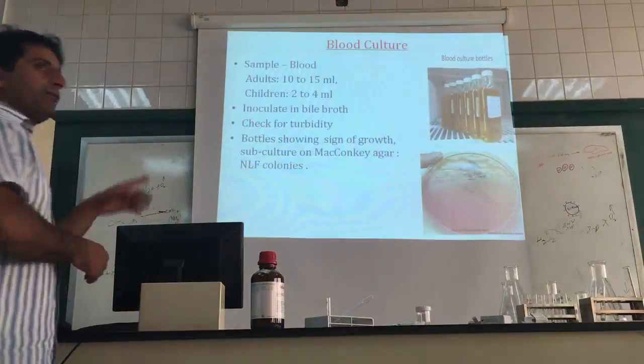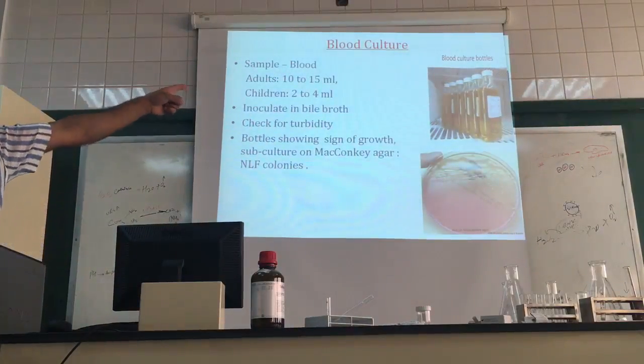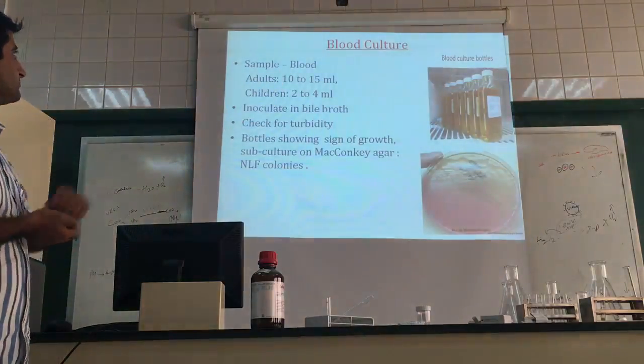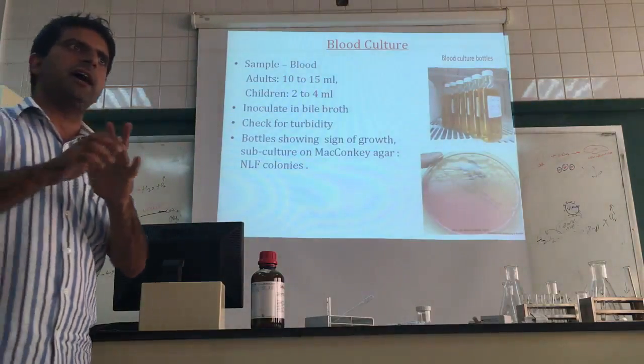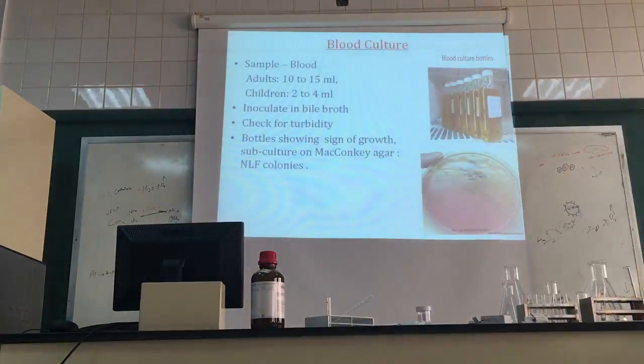Now, if you go for the culture of this microbe, Salmonella, it is better to first go for a broth culture. These are the blood culture bottles here. This is called a broth culture, liquid. Two types of media are there: broth culture media and solid media.